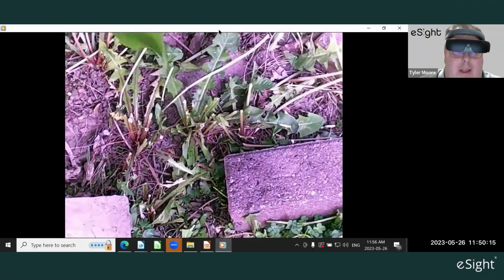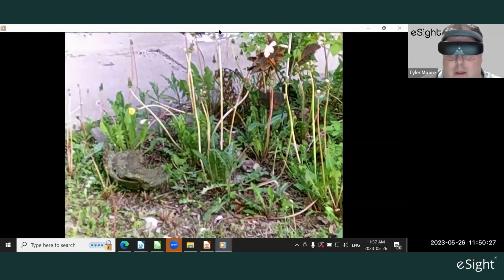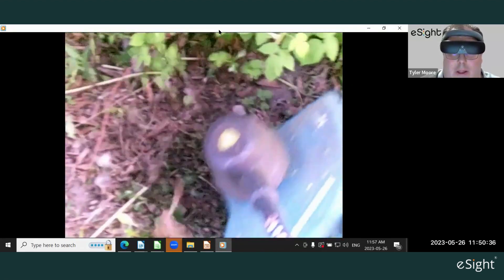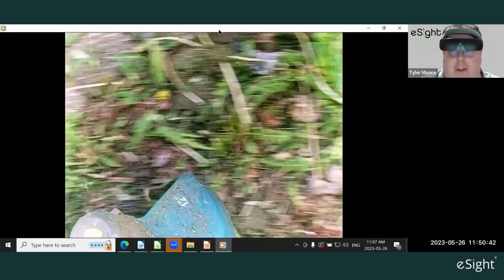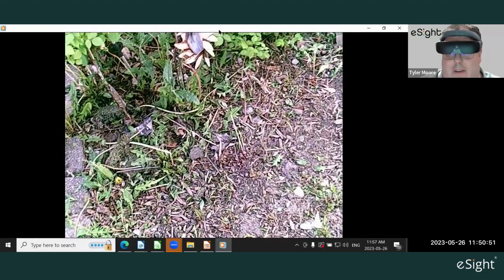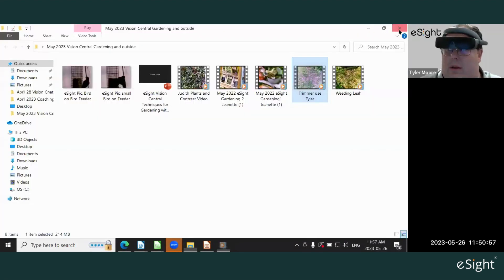It's not exactly a precise technique all the time, but it is definitely more helpful with eSight where I have things lined up. Then there's the edge of the front garden where some tiger lilies are planted. I can use that tilt, look up a bit, make sure I'm not hitting anything — utilizing that zoom and contrast. What I find I do is use about 10x zoom to line up with the head of the trimmer, leave that zoom there, and I can kind of eyeball it when I'm at the right distance to remove the weeds.